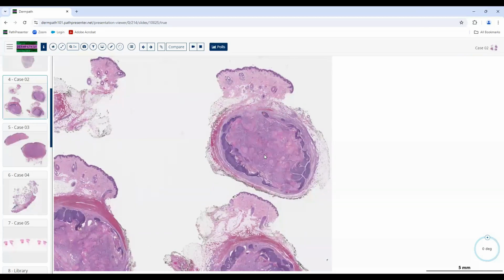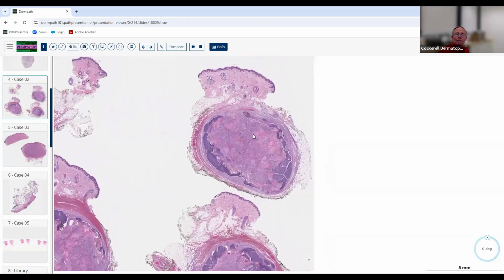All right, I can take this one. So this one looks like it was punched out or maybe an enucleation, or maybe even an excisional biopsy. Yeah, good. It's a beautiful biopsy specimen here. I think it's neoplastic, but it's very well circumscribed, relatively symmetric, so I think it's benign. It's got the same architectural features as the last one, doesn't it? This time we've got skin overlying it, so this again was deep in the dermis. I totally agree with you. Relatively small, symmetrical, well circumscribed, strongly favors benign.